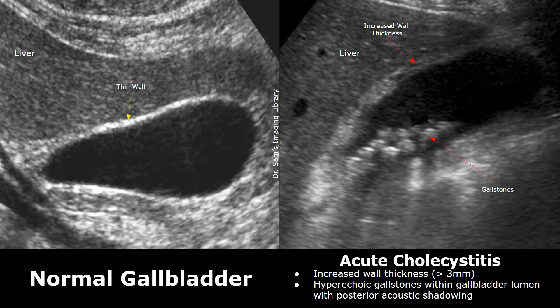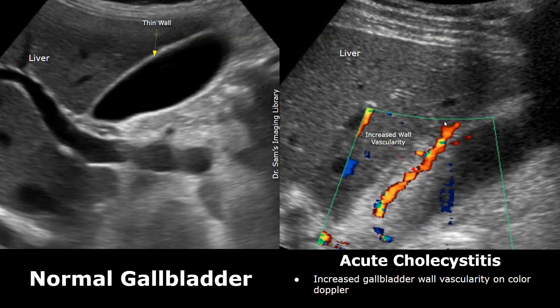This is a case of acute cholecystitis with multiple gallstones. The gallbladder wall is also abnormally thick. If we apply color Doppler on the inflamed gallbladder, increased vascularity is seen in its wall. We see prominent blood flow in the wall, which is not present in a normal gallbladder wall. Many color Doppler signals are present in the wall. So this increased wall vascularity seen on color Doppler is also a feature of acute cholecystitis.